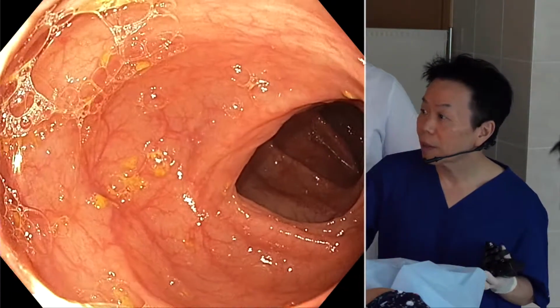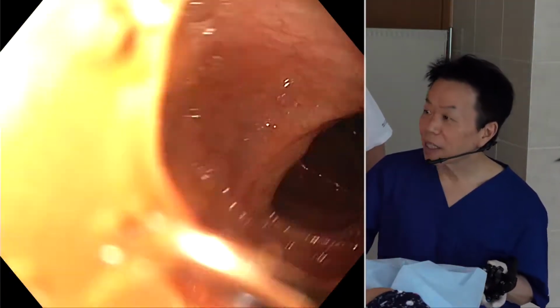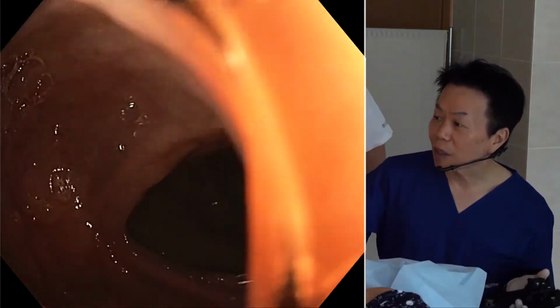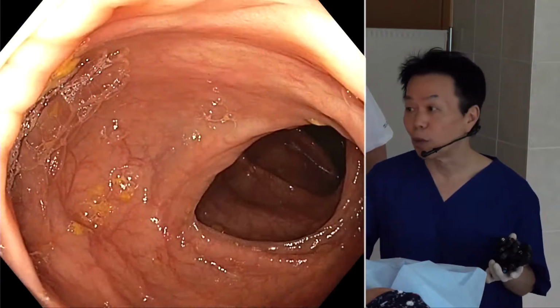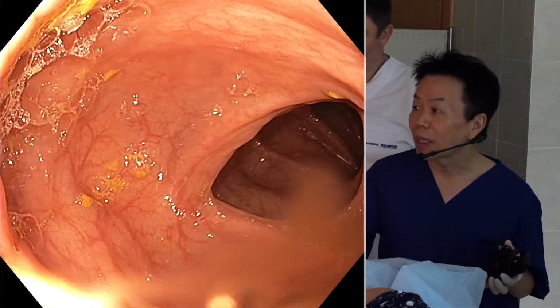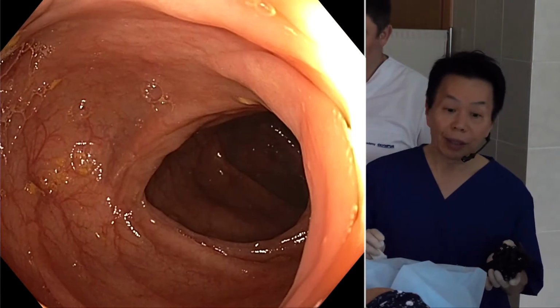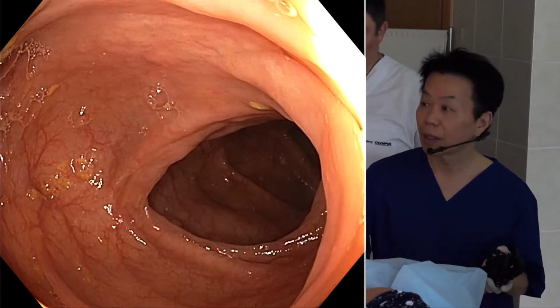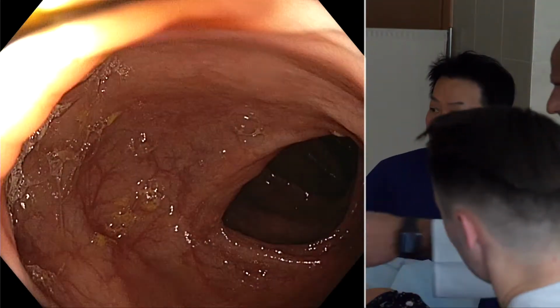Now I think the tip of the scope is in the transverse colon, but as you can see, when I push, the tip of the scope goes back. It's called a paradoxical movement. In this case, maybe you have to try another thing. Maybe often the time I change the position of the patient. Can I change to the supine position? Maybe.